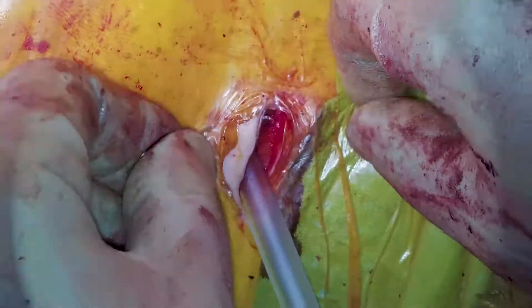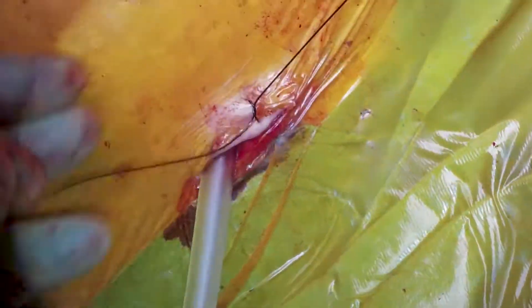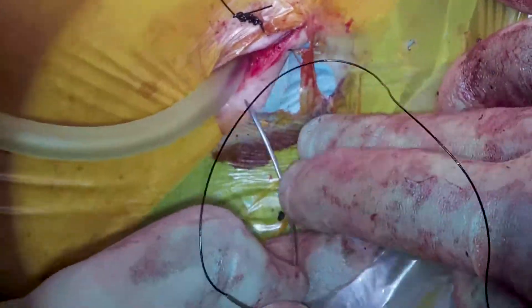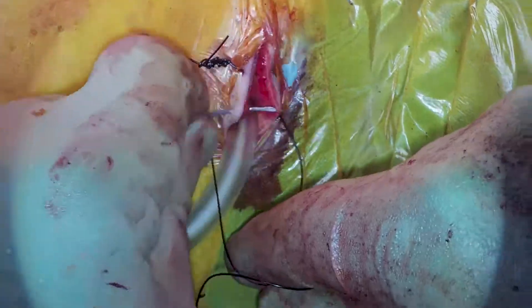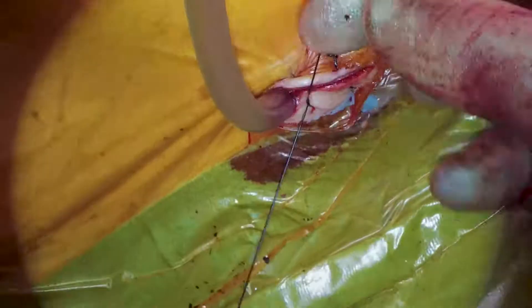We're placing a chest drain here via a sub-xiphoid incision. Mr. Dunning uses this site because patients have less pain with an incision here. This is actually the same hole used throughout the operation to fire the staple gun through, so no extra incisions are needed for the staple gun or the chest drain — everything uses the one hole.